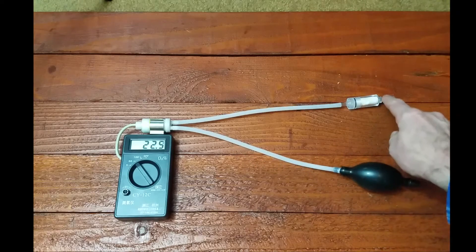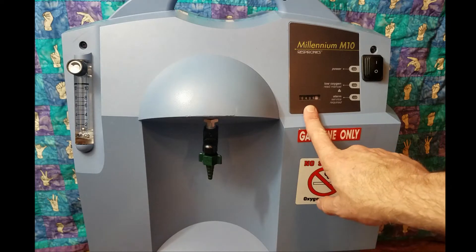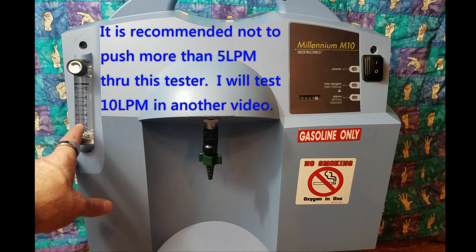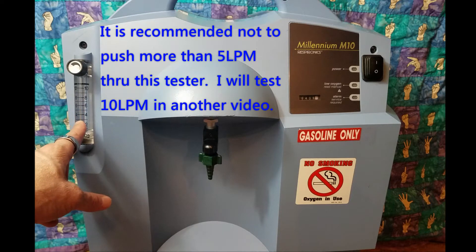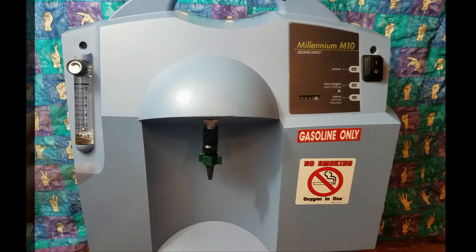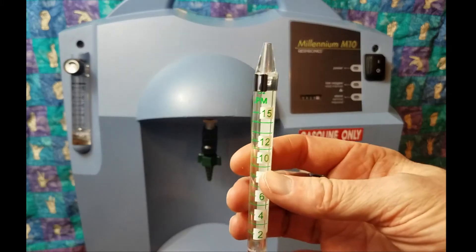It's actually pulling in from here and then sampling. Like many people, I ordered a refurbished unit with over 10,000 hours on it, and it's sat here for two and a half months until I've been able to test it. One limit of this system is the flow rate — I'm not going to set the flow rate above five liters per minute, even though this is a 10-liter-per-minute system. We'll use another method to test the full flow rate, but we'll see what the oxygen purity level is up to five liters. Some people say you shouldn't push 10 liters a minute through this limited tester. When it was rebuilt, it was actually pushing 12 liters per minute — we have a limit of 10 here, but this flow meter goes up to 15.